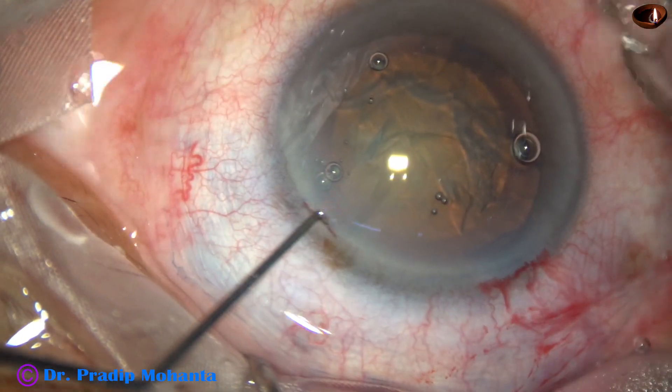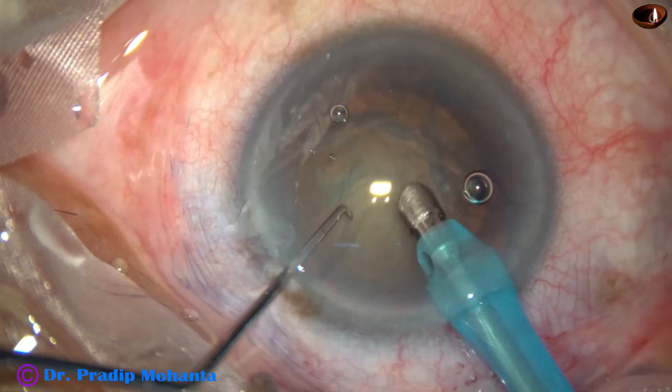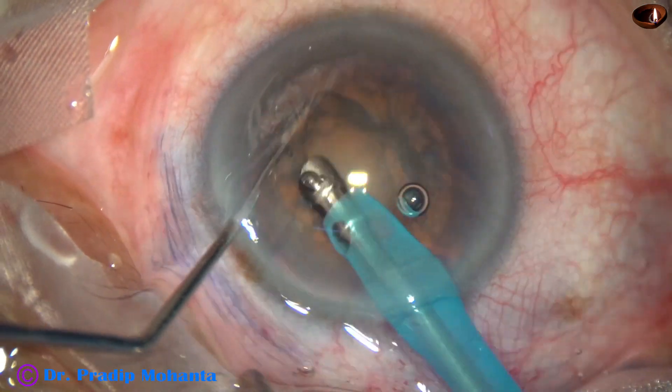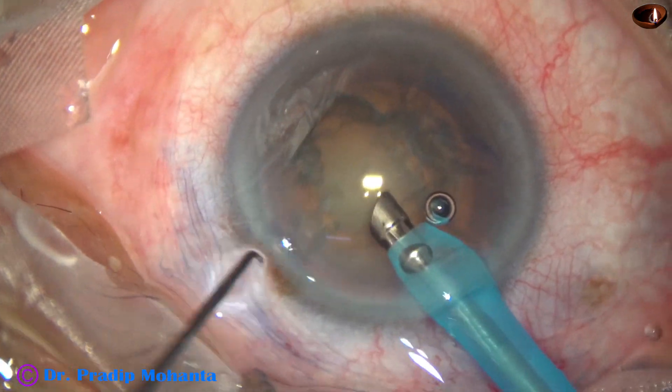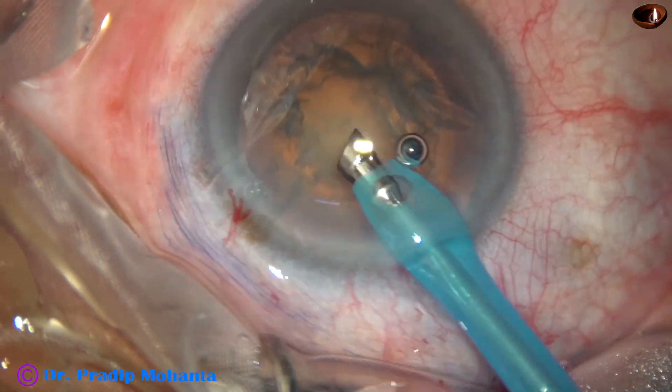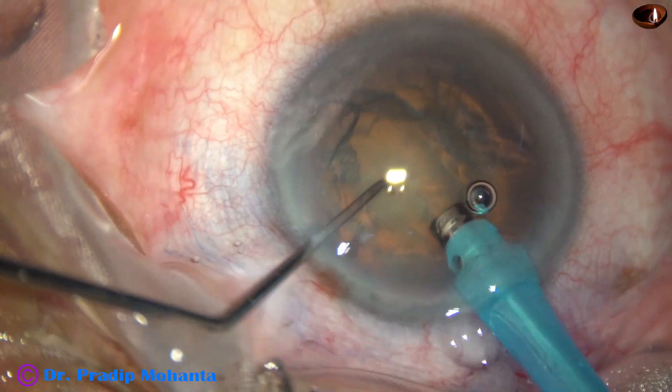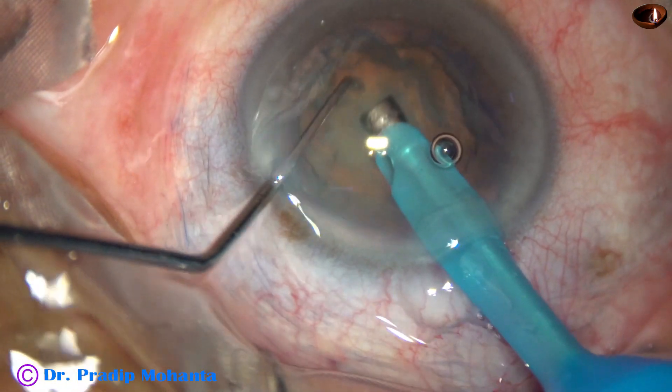In Stop and Chop technique, we make only one trench, divide the nucleus into two hemi-nuclei, and each hemi-nucleus is chopped into pieces. This is how we make the trench.